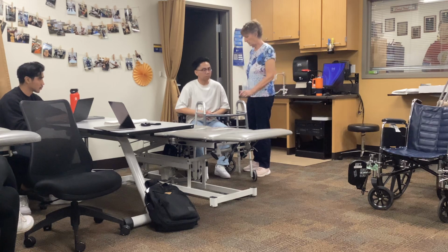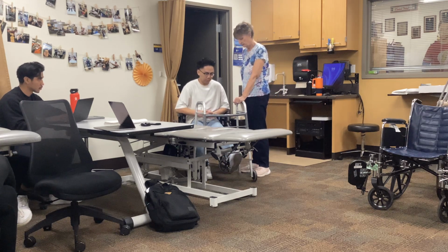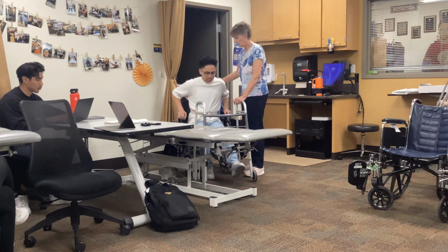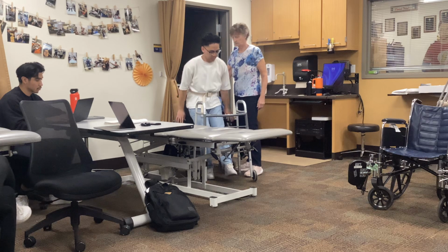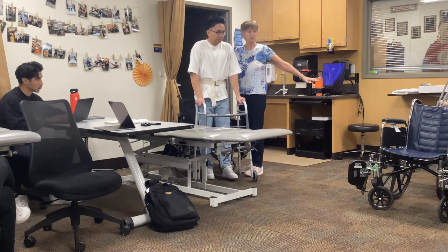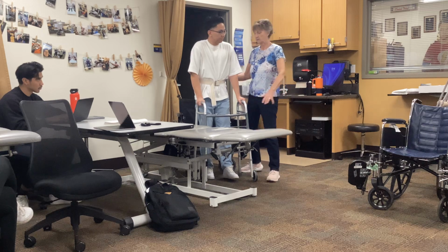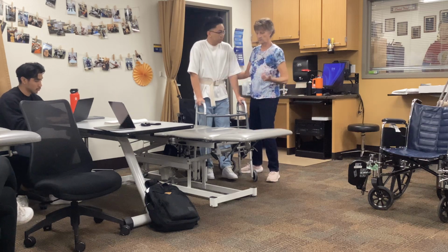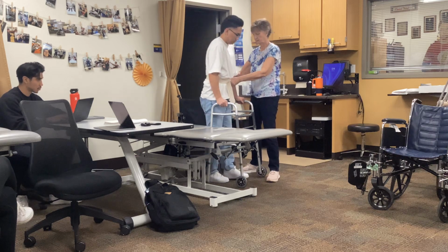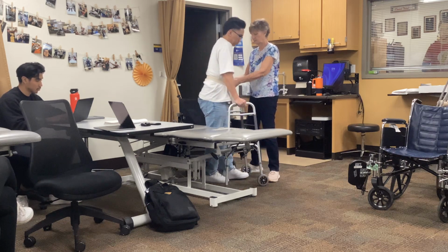So you tell me, what do you think you're going to do? Non-weight bearing, I'll have my leg up. And then I'll scoot up a little bit in the chair, push off the armrest, then onto the walker. Okay, all that was the same. Now I want you to turn your walker towards me so your bottom faces the table. Take little hops.